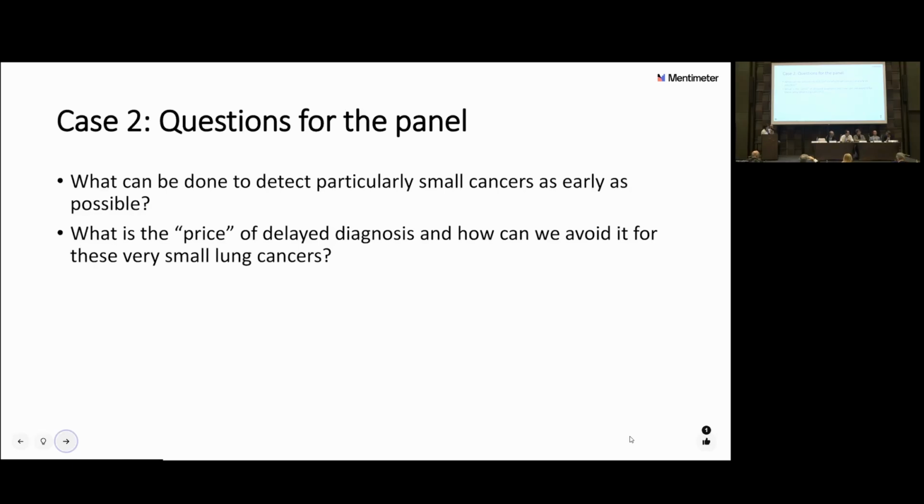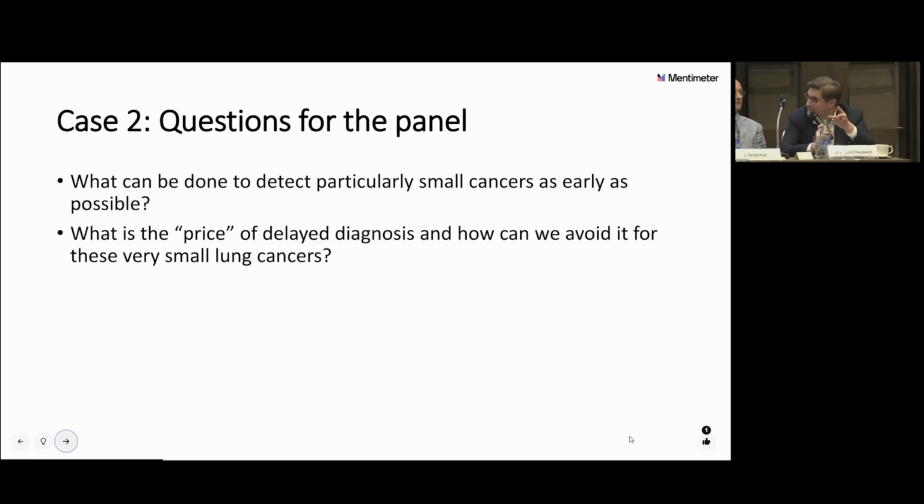No, I would say if it's intermediate in the first one, right? I'm not sure what the volumes were, that were less than the threshold, I guess. But then there's a kicker you didn't mention. You mentioned it's a history of prostate cancer, right? This changes the game. This is not just a smoking healthy adult. So in that regard, one would say, okay, it has nodules, and check the PSA because this could be metastasis as well. Okay, and if it was negative? We would follow. Yes, we would follow. And it said probably benign, Lung-RADS 2. We use Lung-RADS and come back in 12 months.